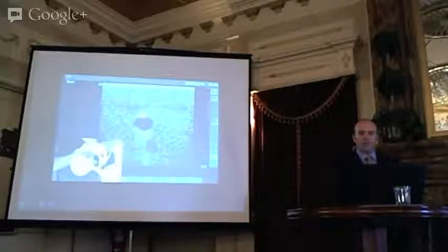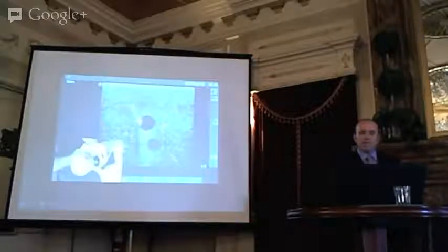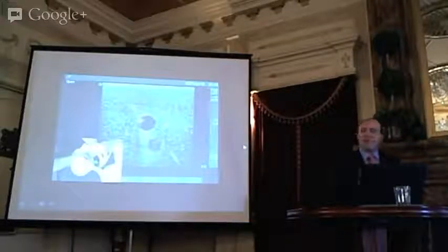You can see if you're right over it. Now, I did not adjust my transducer position, so as I do, I realize that I'm actually on the side of the vessel. In fact, I'm almost going in. And problems happen when people lose track of where their vessel is and what the needle tip is doing. And this is what happens in short axis. You have your vessel coming out of the screen towards you in this case, and you're cutting with a transducer or with ultrasound beam straight down.